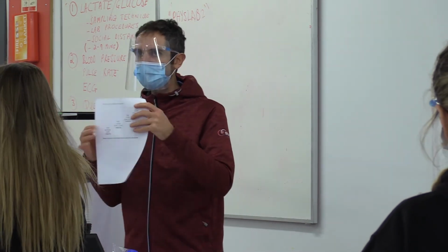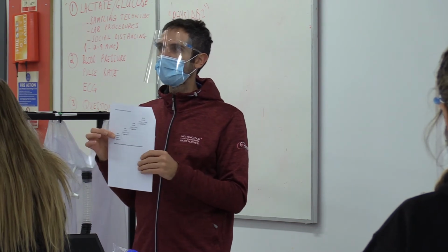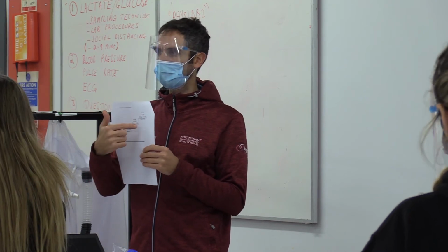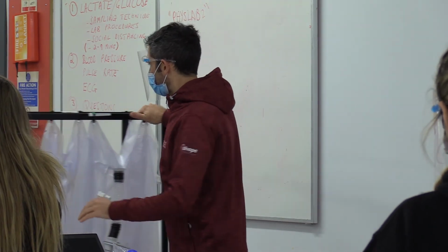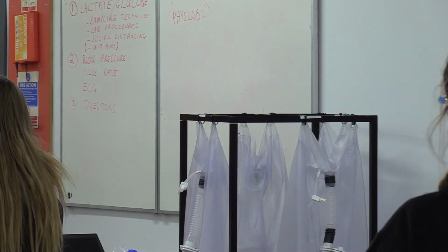Okay, so these bits in here, you can follow these, unless you're some kind of elite cyclist, it might be too easy for you. So you can add on some extra weight at the end. Okay, so we're going to exercise on these bikes.